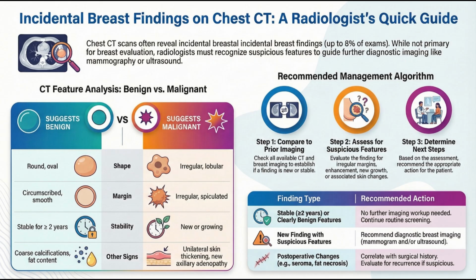Everything. For instance, we saw a lot of reactive lymphadenopathy after the COVID vaccines. Nodes would look big on CT. But they weren't cancerous. No. In many cases, they were back to normal in about 4 months. The takeaway is you can't just see a big node and jump to conclusions. You have to ask about recent vaccinations or infections before you start a big workup. A good medical history is key.